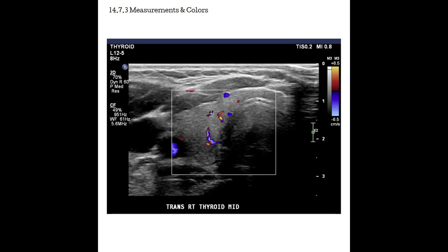Modern monitors are also capable of displaying colors, so now we can see colored Doppler information when we use that tool. Most of our modern systems use LCD screens, and those LCD screens have over 700,000 elements on the screen that are capable of not only those 256 grays, but colors on top of it. So systems that are able to display color are technically 24-bit systems because they have 8 bits of memory assigned to each primary color of light: red, blue, and green. So those 8 bits for those 3 colors means that we are at a 24-bit system. And with that 24-bit system, using the red, blue, and green, we can display over 17 million colors per pixel on the display.